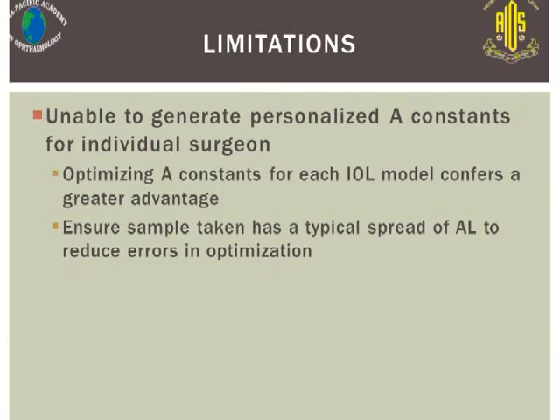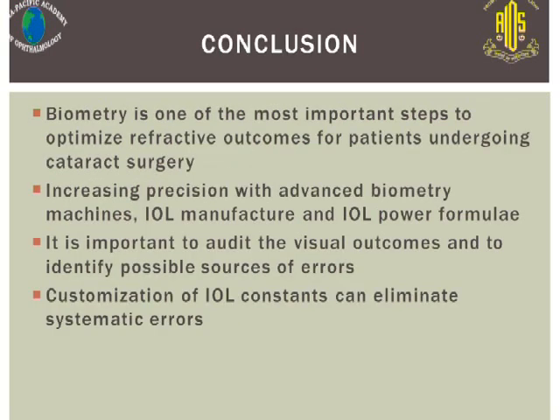We recognize our limitations in that we were unable to generate personalized A constants for each of our 40 surgeons, but it is generally agreed that optimizing A constants for each IOL model confers a greater advantage. Also, we have to note that because the A constants do not vary with the axial length, during the audit we have to ensure that the sample taken has a typical spread of axial lengths to reduce errors in optimization.